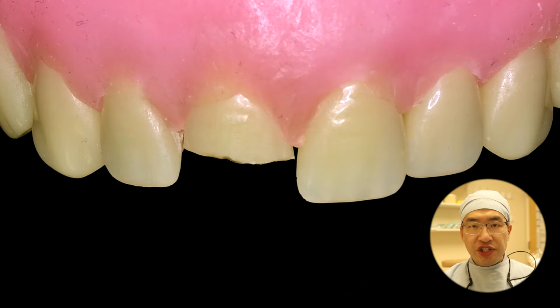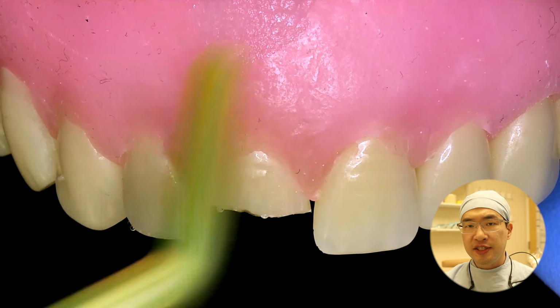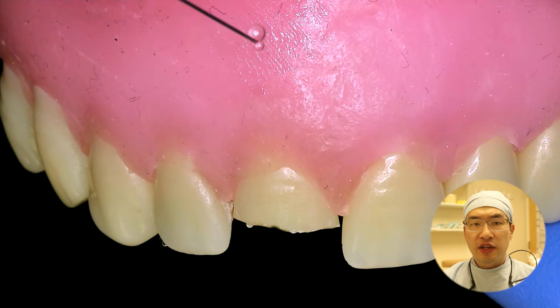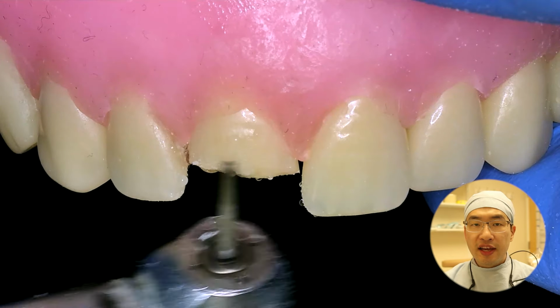So today I saw a patient whose front tooth broke while she was working, unfortunately. She presented with a severe cold sensitivity, but luckily there was no sign of nerve exposure, so we could avoid a root canal treatment. I gave her two options.